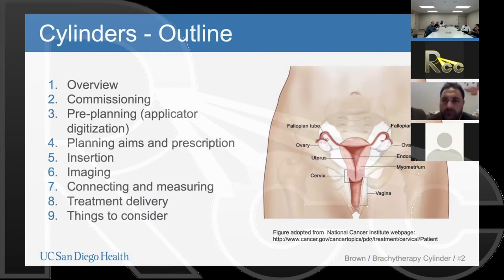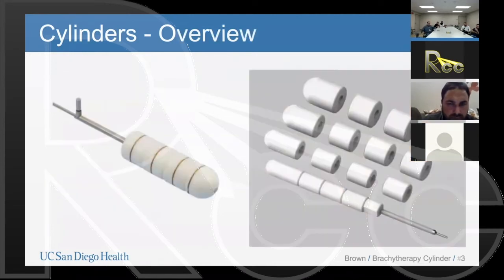Talk about the insertion, things to think about, imaging if you are going to use imaging, how to connect and measure for a cylinder treatment, how to perform the delivery, and then some special considerations for when we are treating cylinders. Okay, so here's what a cylinder looks like.